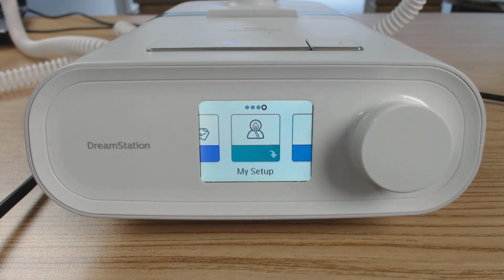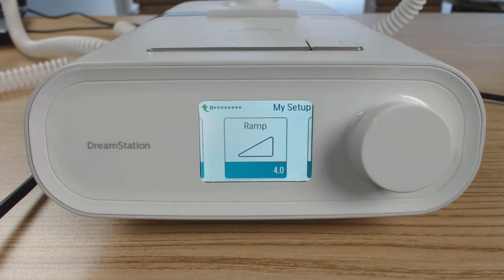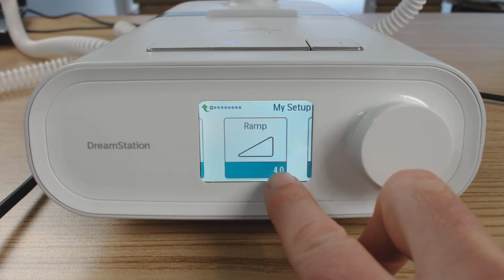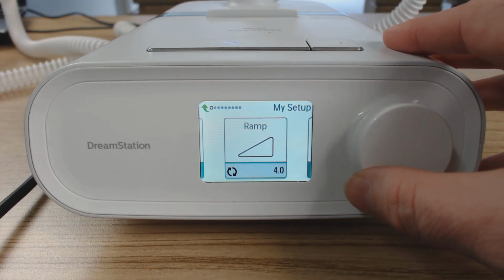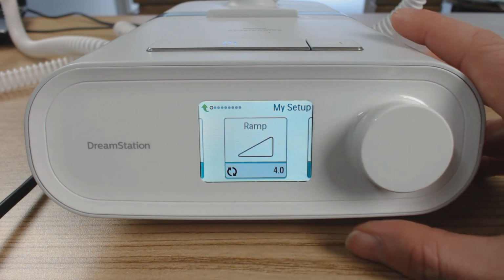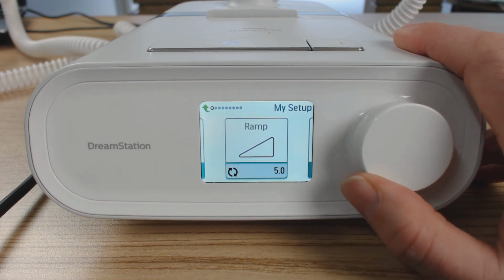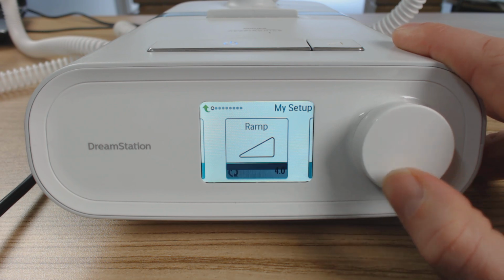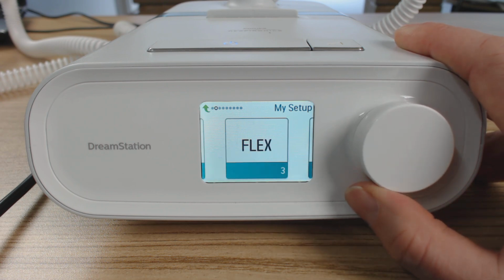And then the last one, which is important, is My Setup. So let's go into My Setup and have a look at what we've got here. Keep in mind, once again, this is the Pro version, which is the fixed pressure one, not the automatic. So the first is ramp. It enables us to change the ramp value, and because this machine's set to I think 10 centimeters, this is the ramp start pressure. A bit higher if we want to. We're going to just keep it at 4 for now, so don't worry too much about that.